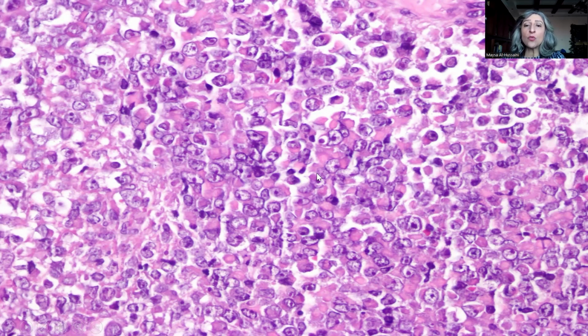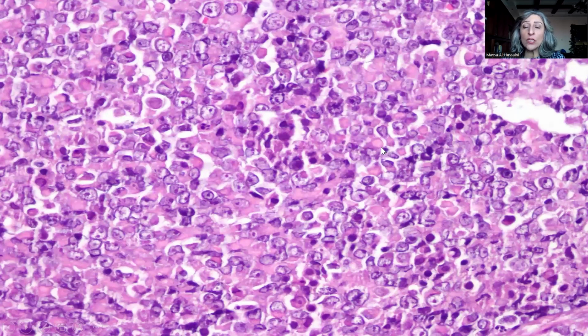And these are cells with vesicular nuclei, very prominent acidophilic nucleolus, and then an eccentric part of the cytoplasm filled up with a globular, acidophilic inclusion within the cytoplasm of the tumor cells that is displacing the nucleus to one side. And this is the typical rhabdoid appearance of the tumor cells that was originally described, whether this was in the kidney rhabdoid tumors, in the ovary, or even in the brain in the atypical teratoid rhabdoid tumor.